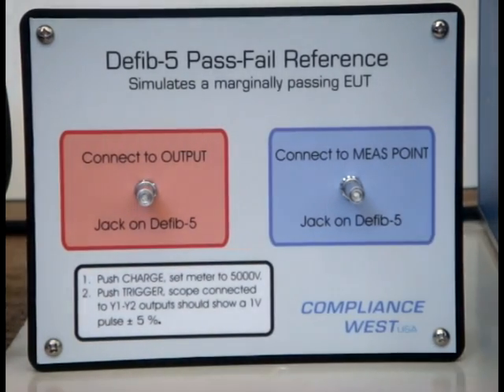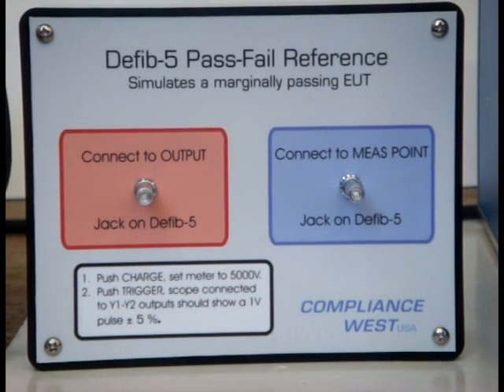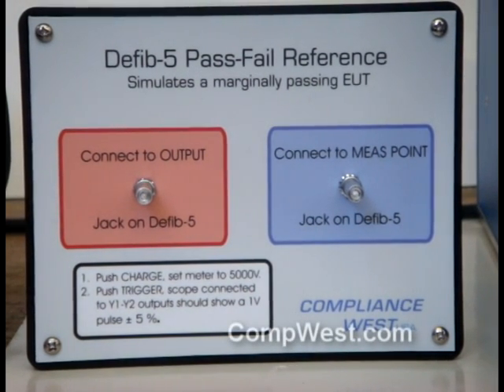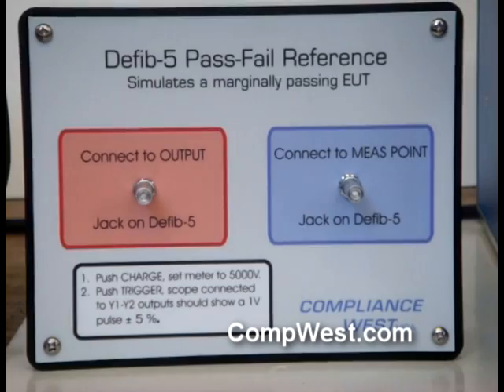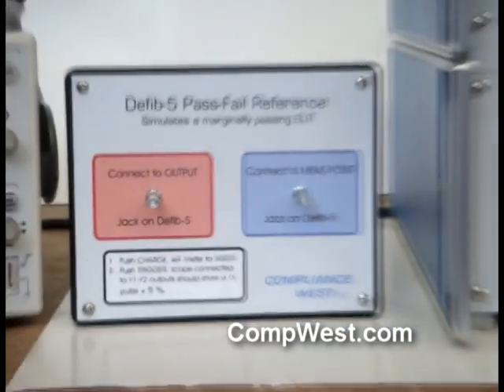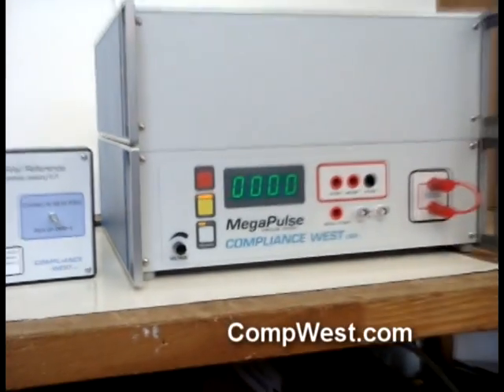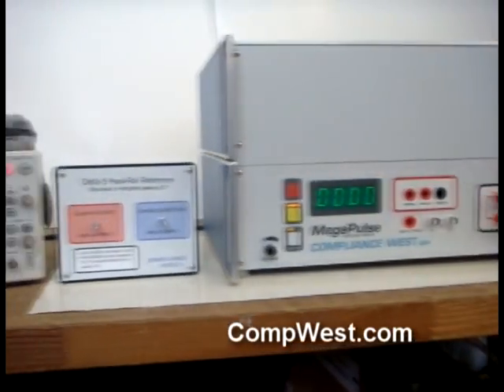Per the standard, if the output to the oscilloscope is more than one volt, the result is a test failure. Our test setup consists of the DFID-5, the pass-fail reference, and an oscilloscope.